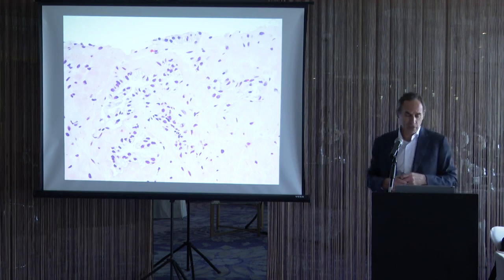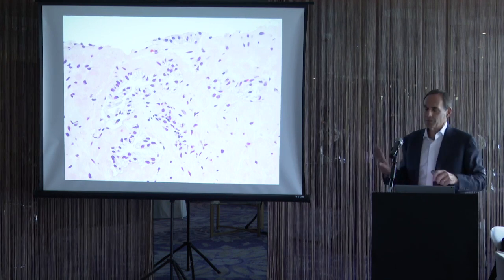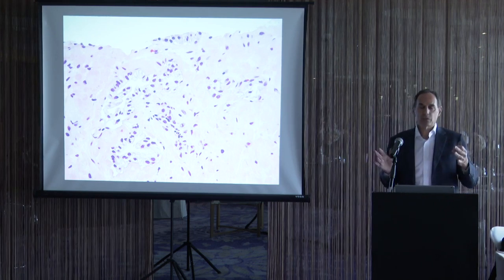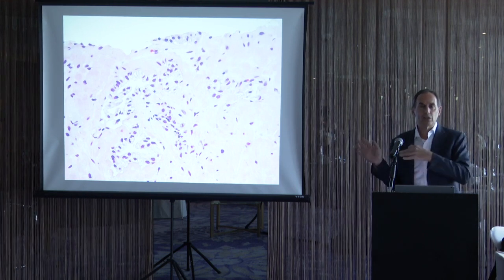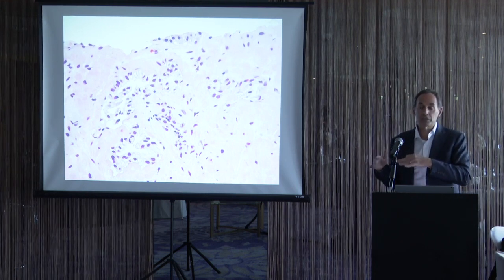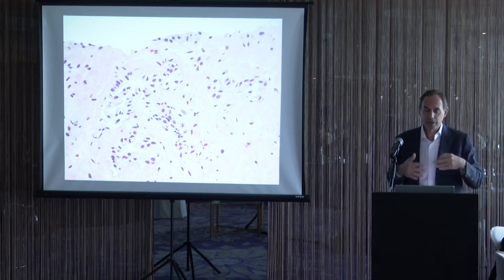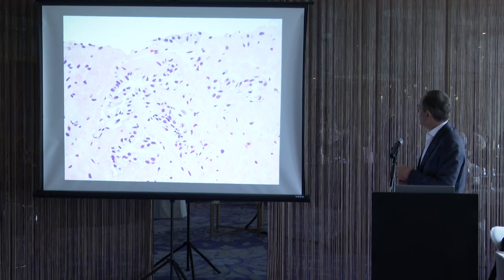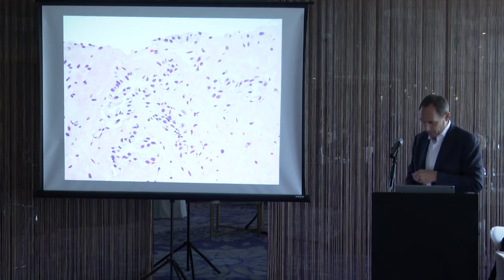Here's another case of partial atrophy, classic partial atrophy. And these cases that I'm showing you of partial atrophy with special stains, these are cases that were sent to me where the outside pathologist had done the stains. If I had looked at these cases just in my own practice, I wouldn't do the stains because they looked like partial atrophy. But just to explain to you the pitfalls with the stains, here's a case, again, no question it's partial atrophy, scant cytoplasm, benign cytology, ruffling of the luminal border.